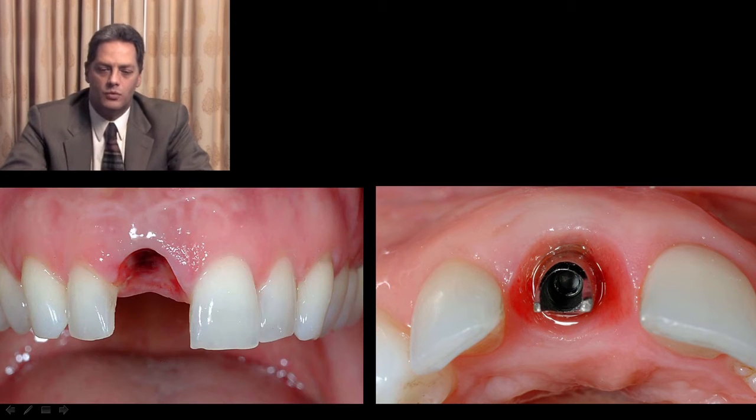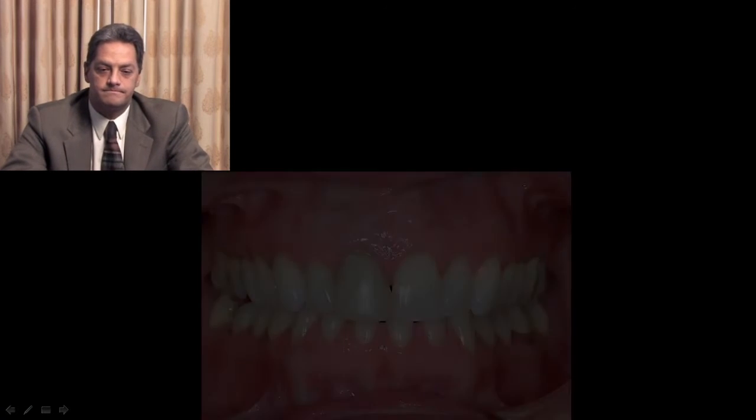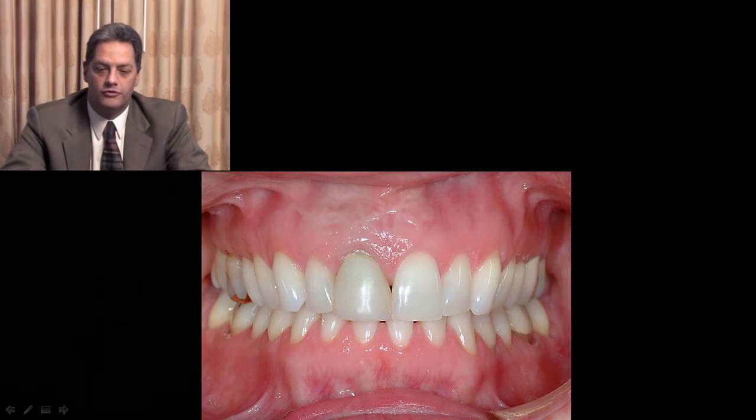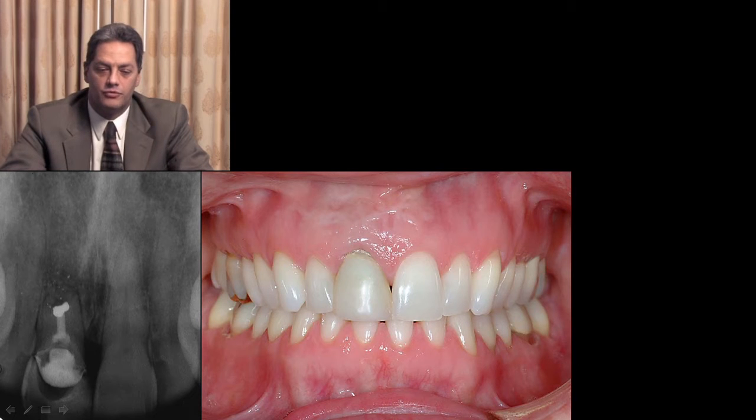Underneath, what we had before was a tooth that had to be extracted, and gingival levels were fairly high. In this particular situation, the biggest problem happens to be with the surgeon who has to build up the bone and recreate those gingival contours to what the patient wanted in the first place. This we can see how the patient came to us in the first place. So we can see that the problem was not only an aesthetic one, but a health one as well.